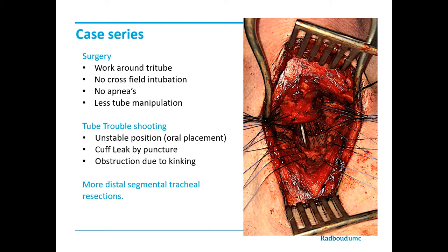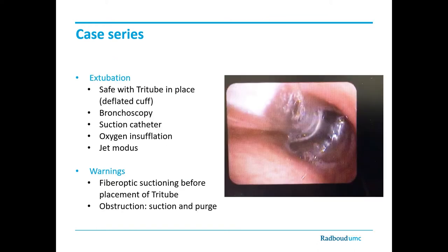During our study, we had 2 patients presenting for more distal segmental tracheal resection. And in those patients, it was not possible to use Tritube, but my colleague Guillaume Riese will tell you more about that. We think that Tritube adds more safety to extubation procedures after tracheal resection because of the better possibility to perform bronchoscopy with the tube still in place.